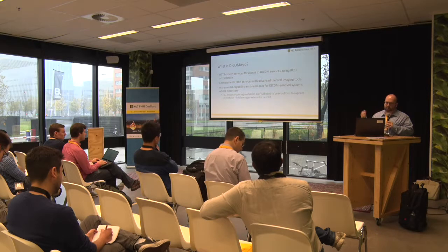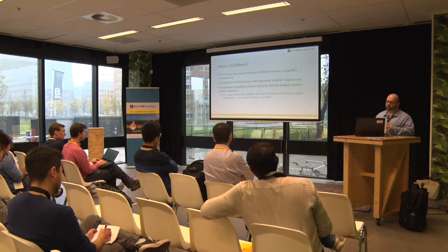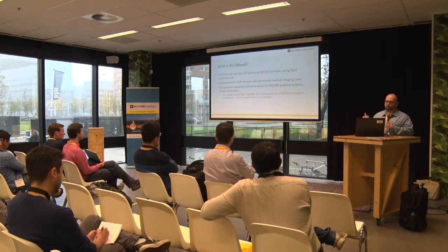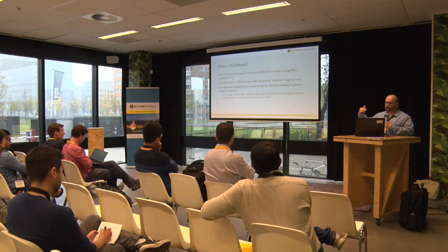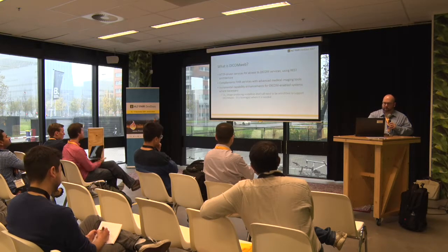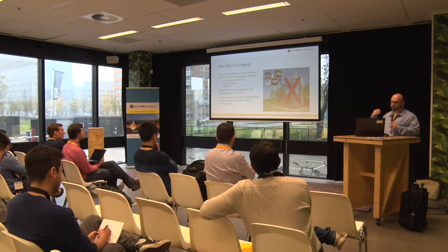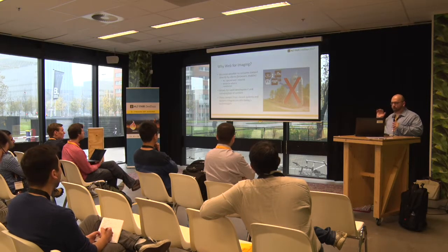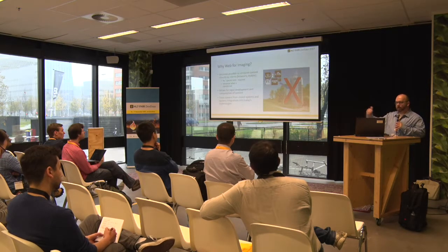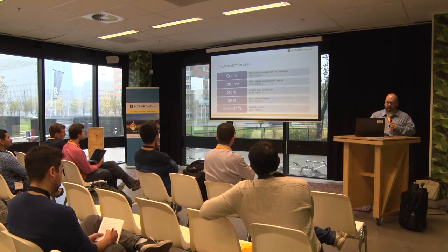So HTTP-driven services using REST complement FHIR services with the imaging study resource, and it really provides incremental capability for DICOM. When we have the legacy system, we want to layer on the HTTP services. When we don't need it, we can just use classic DICOM. What's happened in the past, we had these massive imaging silos where we just put all the images in and they're impossible to get out. And DICOM Web really unlocks that, frees the content so that we can use today's technologies to get these images everywhere they need to be.